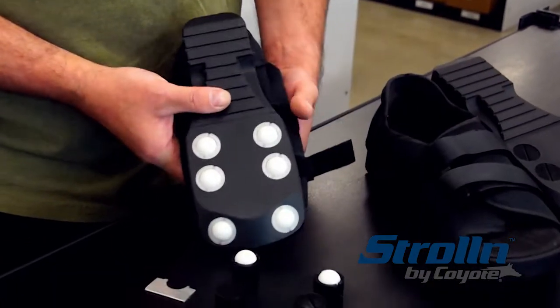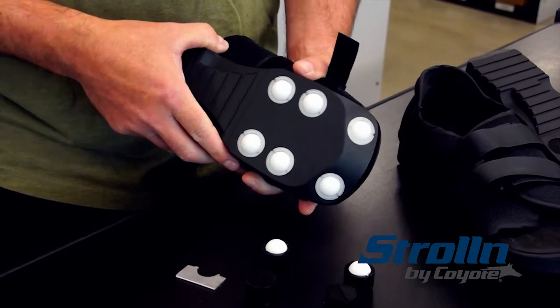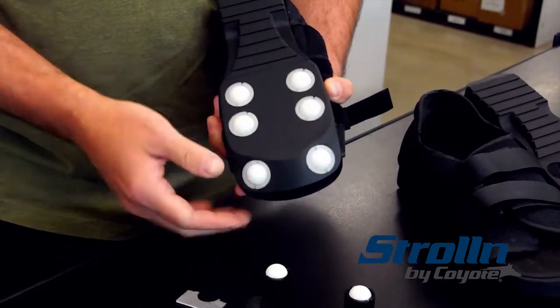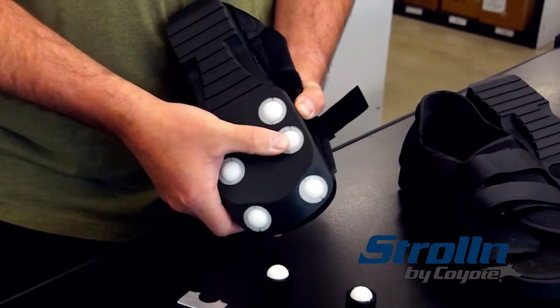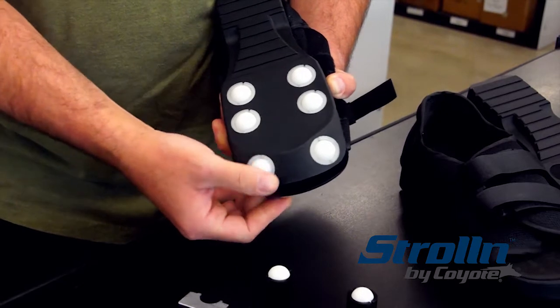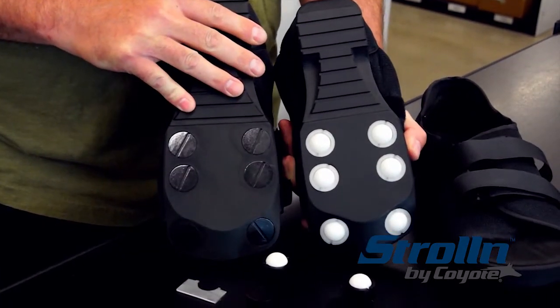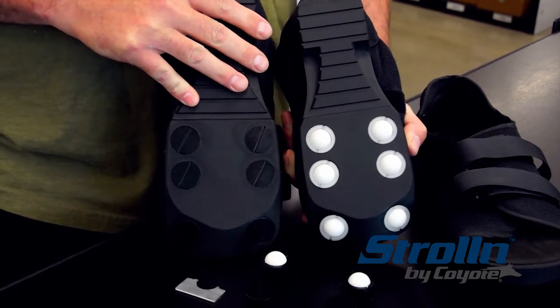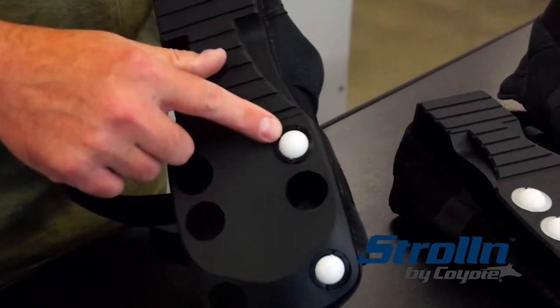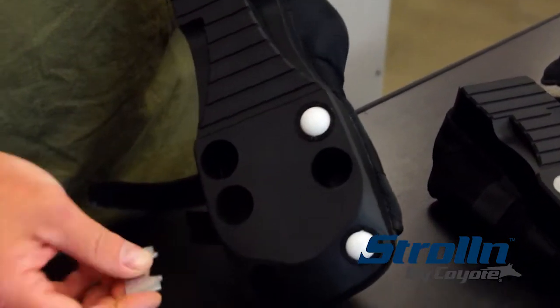So the next thing I'm going to show you is how to replace the bushings, the retractable balls. You'll get your shoes complete with all retractable balls. The 4 in the bottom are retractable, the 2 on the toes are not, they just spin. But if you want to, you can put plugs in, say on one side, and you've got retractable balls on the other.